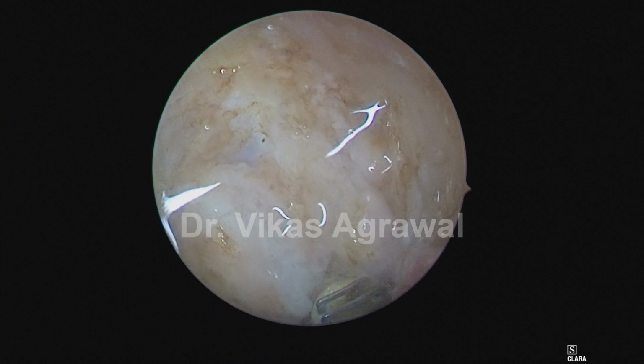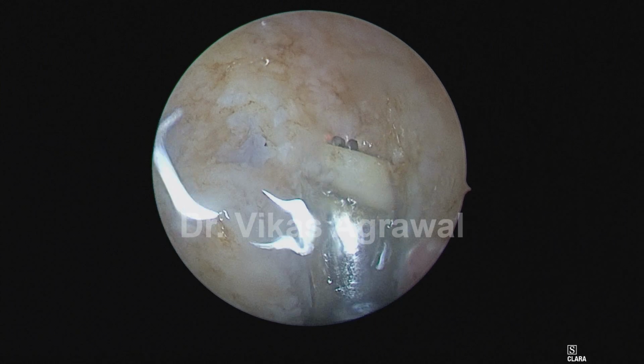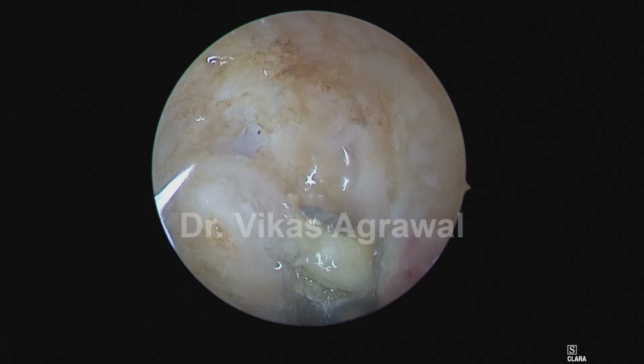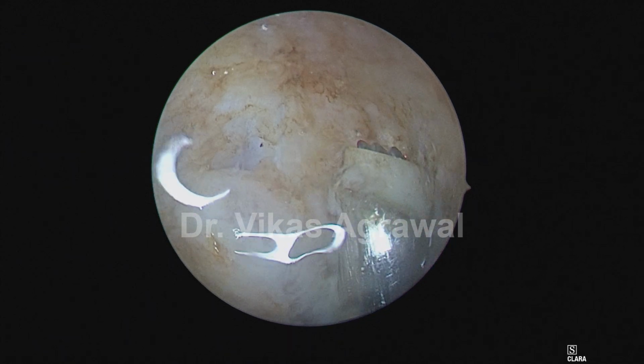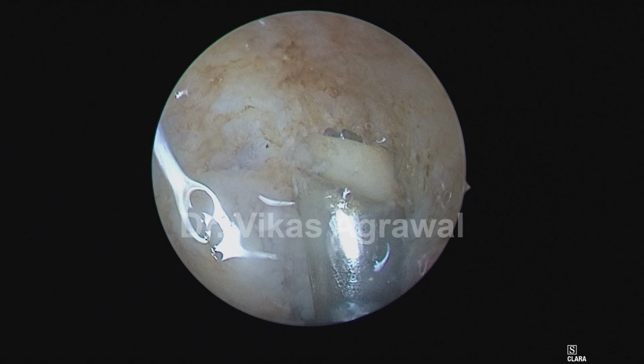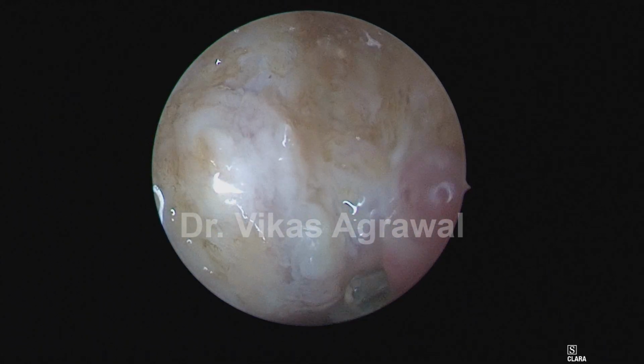We have to be careful about the pulsation of the carotids, if at all the carotid is in an abnormal position. Apart from that, there is nothing major here. Now, the fossa of Rosenmuller is almost completely cleared.